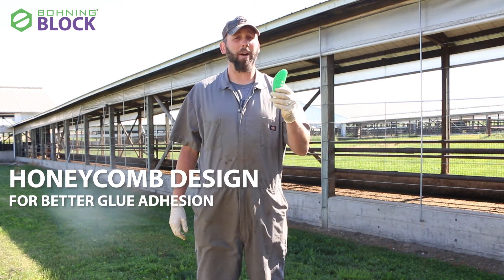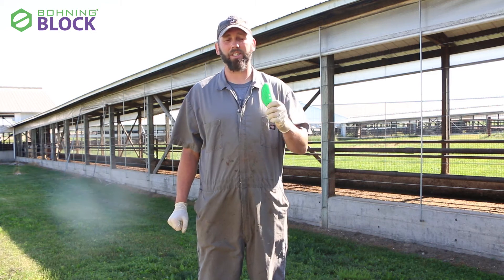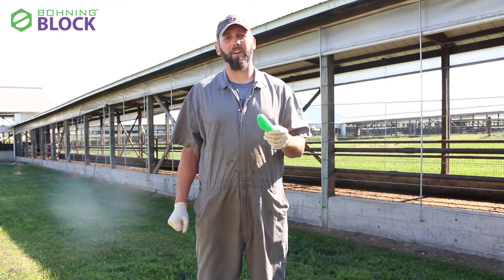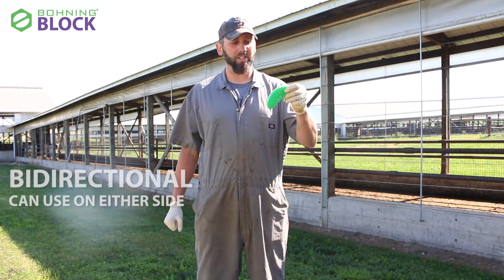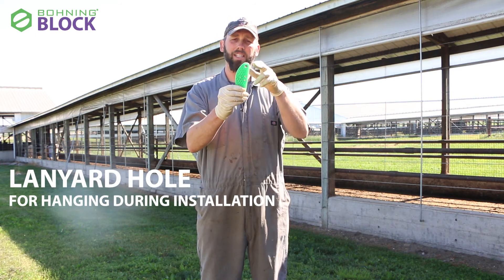I've been testing these blocks for about five months now and I have not seen a block fall off yet, which gives me a lot of confidence. That makes me really happy as a hoof trimmer, and the farmers are really happy with it as well. It's universal — you can use it on both sides — and you can hang it in your chute with this loop.